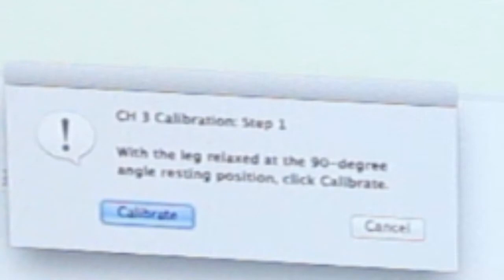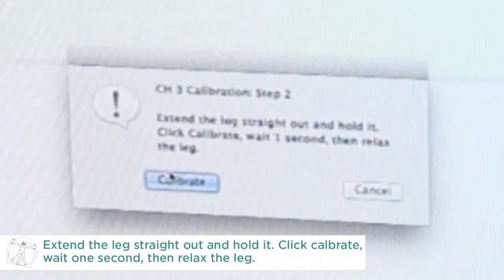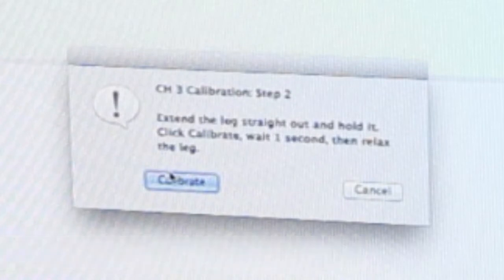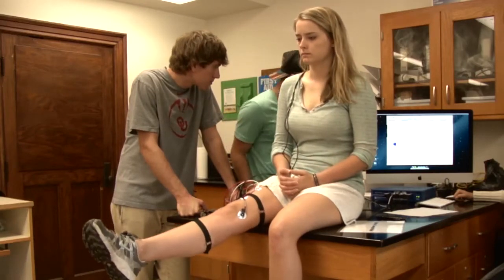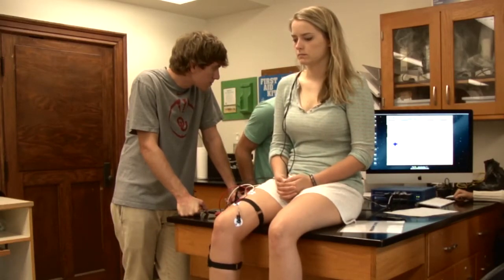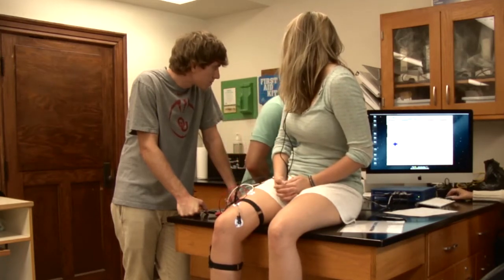We'll have the computer operator click on that and it'll walk you through the calibration. Danielle, go ahead and read those out loud and tell the subject what she needs to do. Before we start any stimulation, hit start in the top corner and have the subject extend her leg out. Make sure the goniometer is in the right direction — it should go up when she extends her leg.